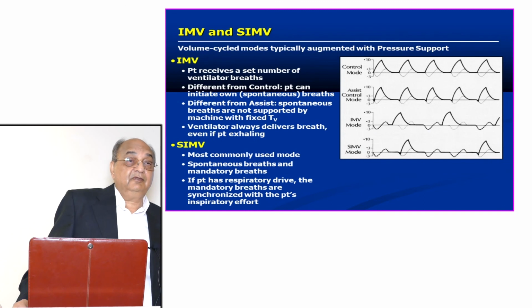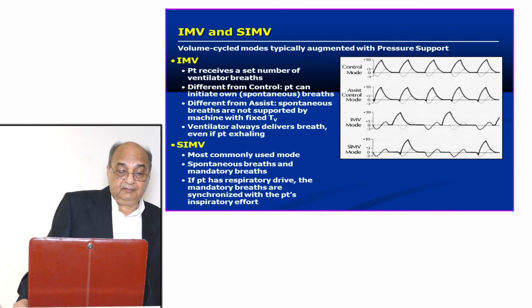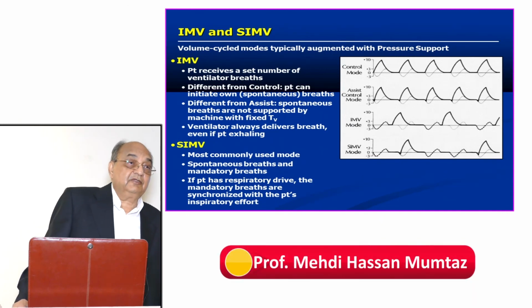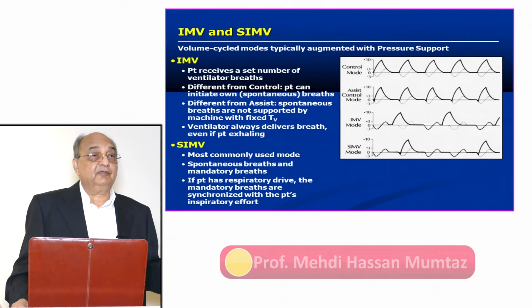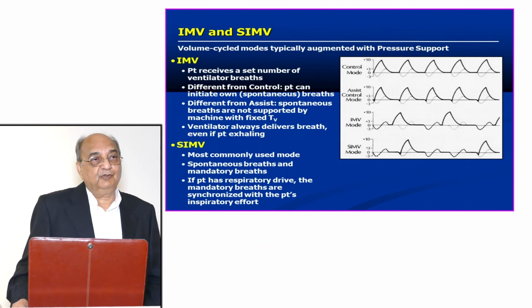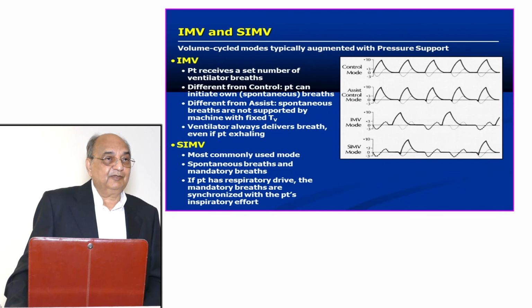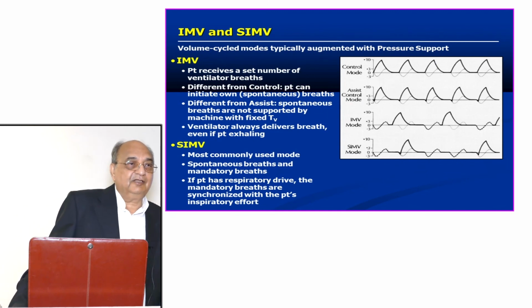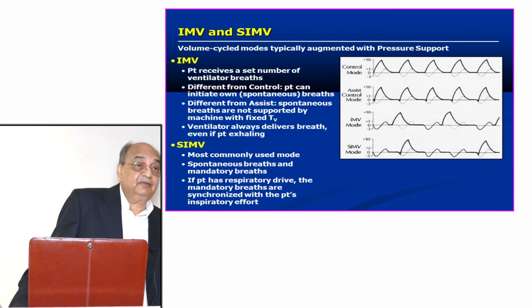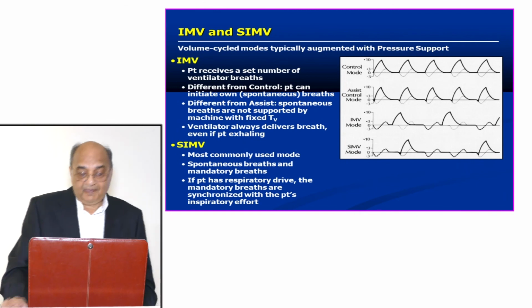I've got a book written by a very famous anesthetist in America. It's a very big book, Weaning the Patient off the Ventilator, only weaning. There are multiple questions on that, so one must read it. So sometimes you are stuck with it, the patient doesn't come off the ventilator. What would you do then? Then you will have to fiddle around with it. So it might take sometimes months. So it becomes a very difficult thing.